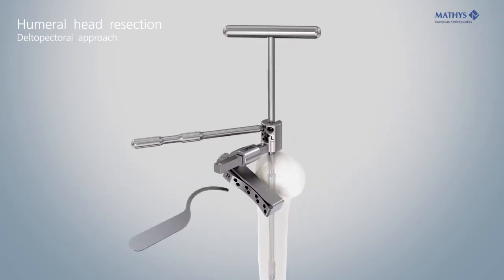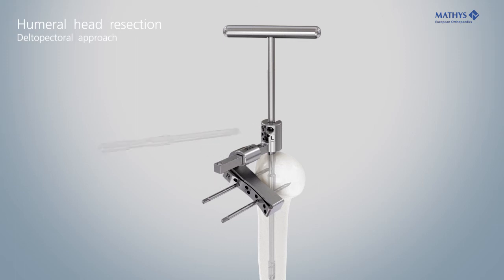Use the stylus to fine-tune the retrotorsion and resection height according to the anatomical conditions. Insert two 3.2 mm pins through the pre-drilled holes. Remove all instruments except the sawing block.